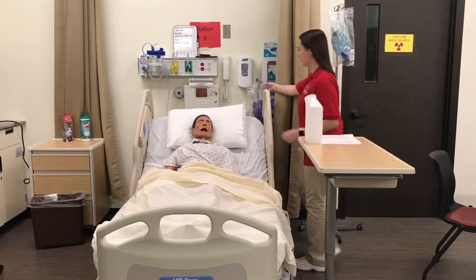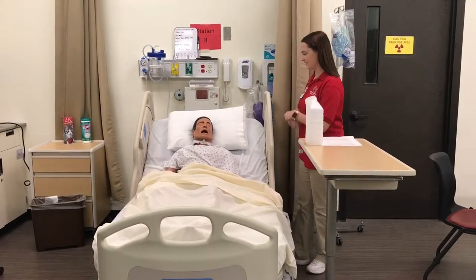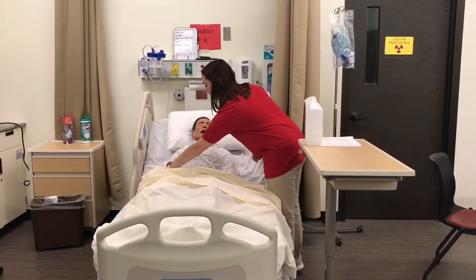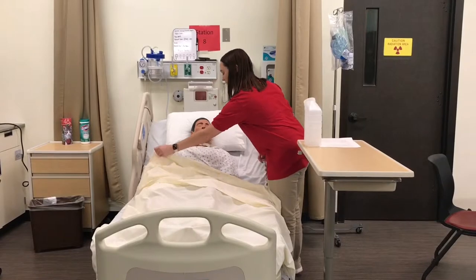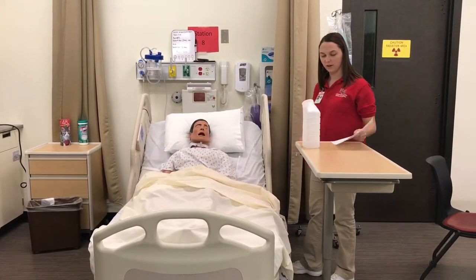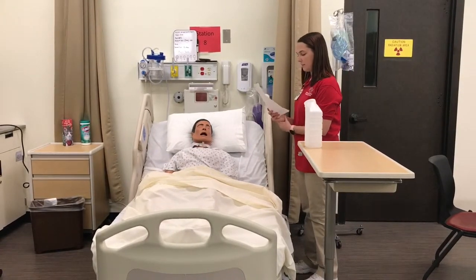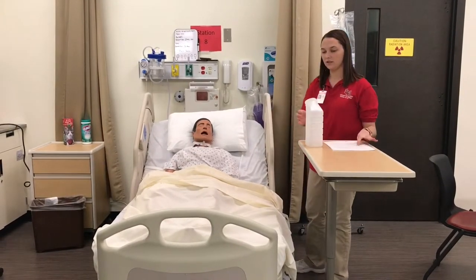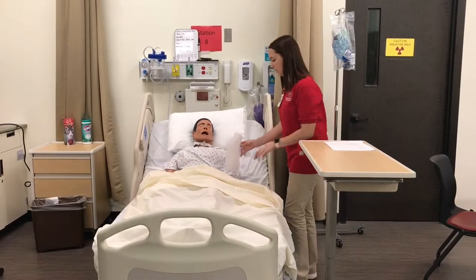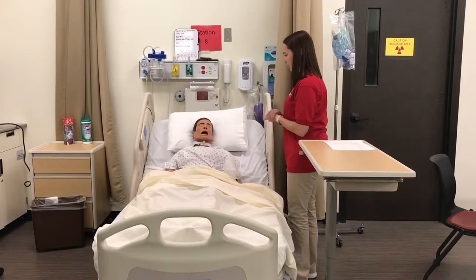Hi Mr. Zang. My name is Micah. I'm going to be your student nurse today. How are you feeling? Can you verify your name and date of birth for me? The doctor has ordered a 24-hour urine collection and strain because of the symptoms you're having. For the first sample we're just going to do the urine strain. I'm going to give you this urinal and after you void you can press the call light and I'll be back to get it.